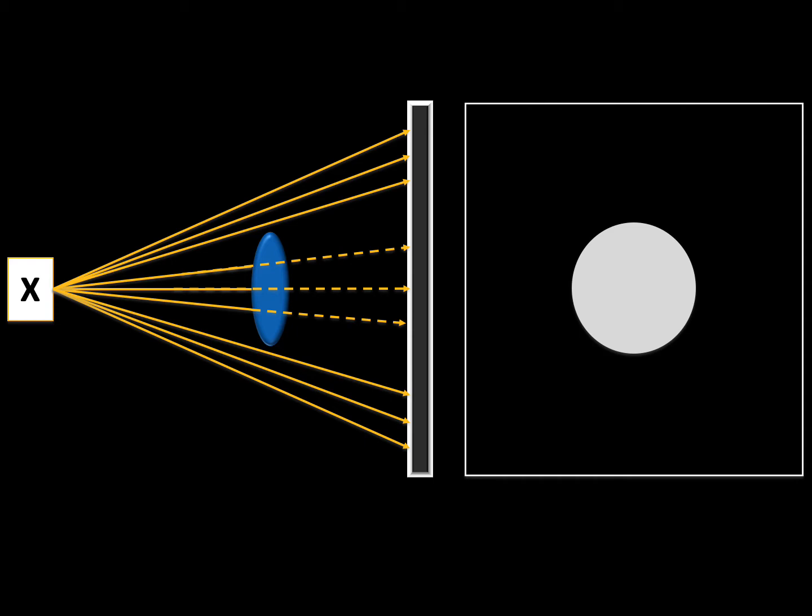So these X-rays with a lesser intensity will hit the film and cause a lesser degree of darkening of the X-ray film. Okay, so what you see at the periphery is black because this is the maximum intensity of the X-rays, whereas what you see in the center are attenuated X-rays, and hence the shadow which we see over here is slightly lighter, depending on the density of the object.